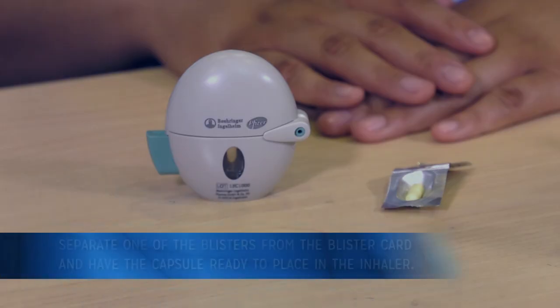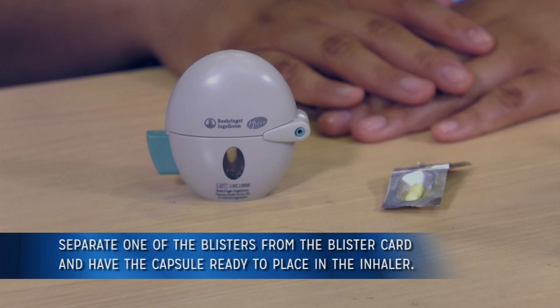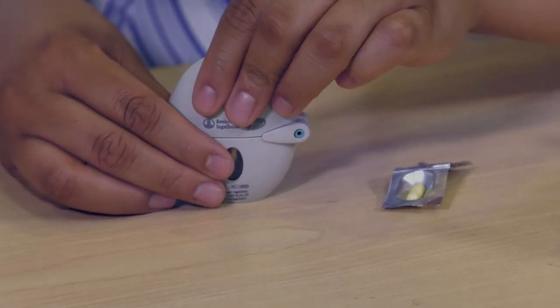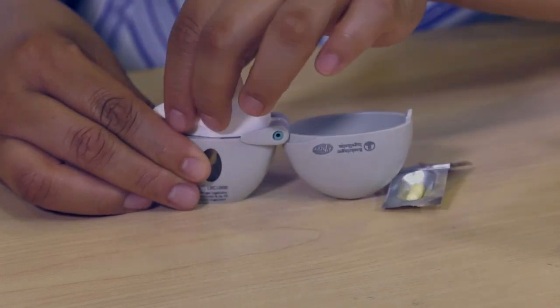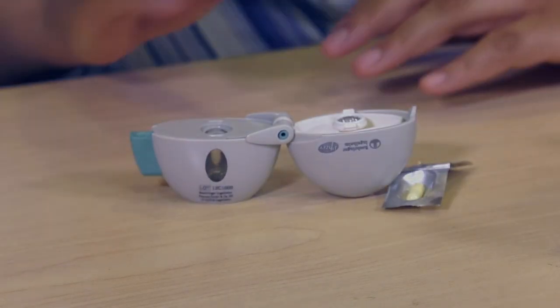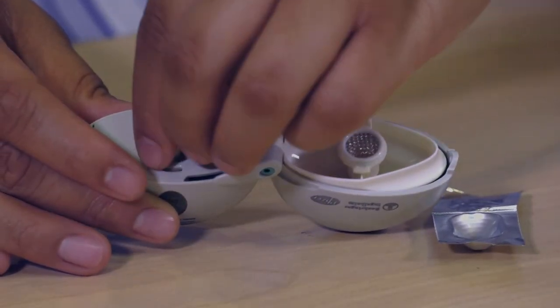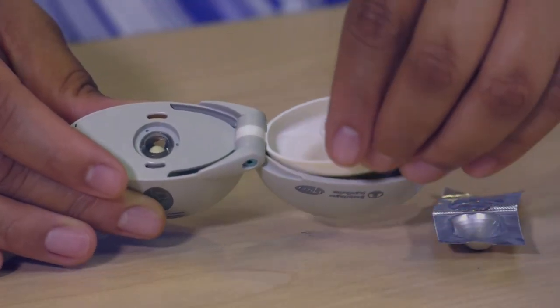To use this inhaler, you will need to separate only one of the blisters from the blister card, then open the blister and have the capsule ready to be placed in the inhaler device. Open the device and then the mouthpiece. Insert the capsule into the device and close the mouthpiece firmly against the base until you hear a click.